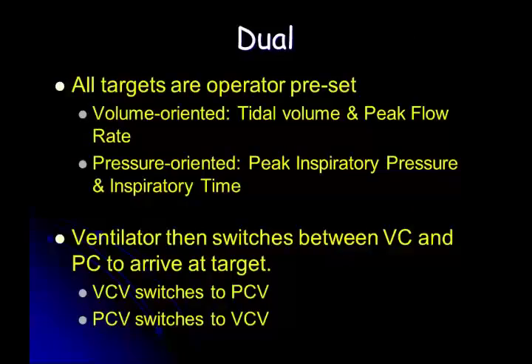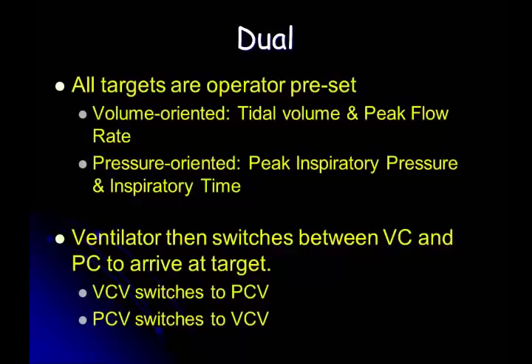Dual breaths are different. When I'm in a set point with volume, I'm controlling the volume that the patient is getting.